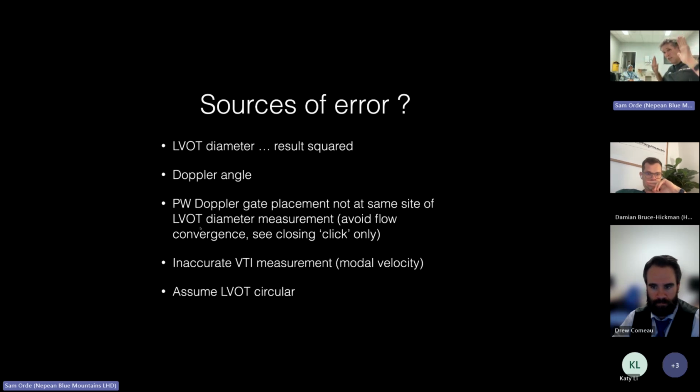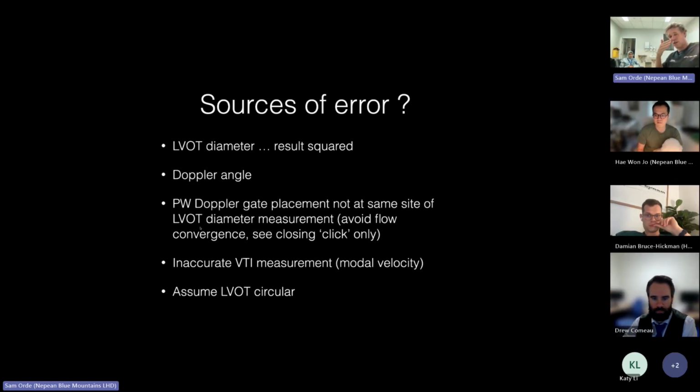If you're standing just at the edge of the doorway, where the door inserts into the doorway frame, the door would just bang you in the face, or you'd feel air coming into your face if you were just before it. If you're measuring the LVOT diameter as the doorway, you want to measure it not in the actual valve. If you're measuring too far into the valve, or too far out of the valve, the LVOT VTI will be artificially low or high.